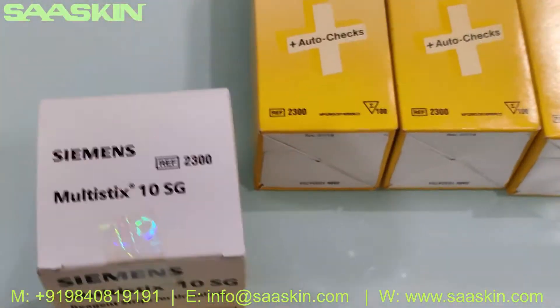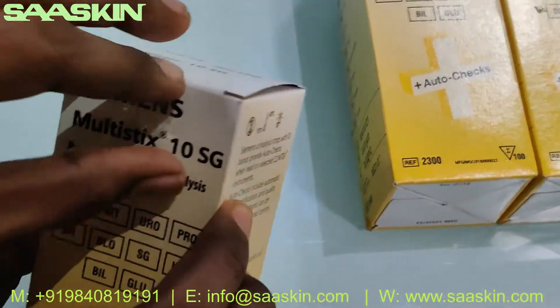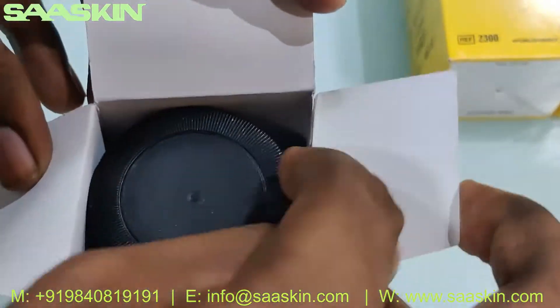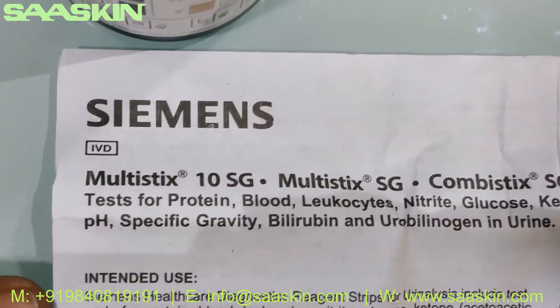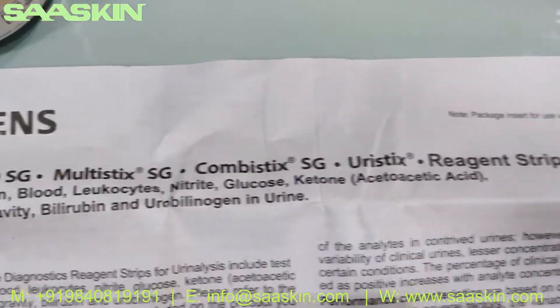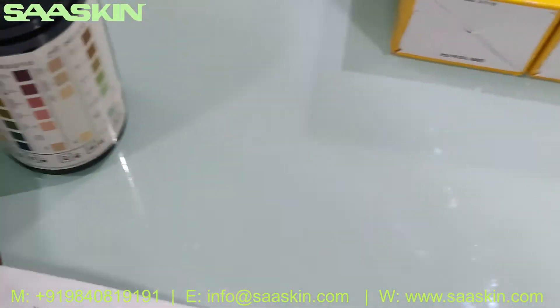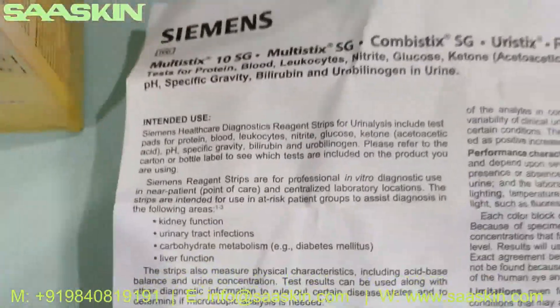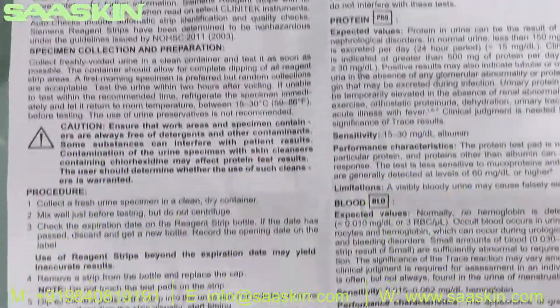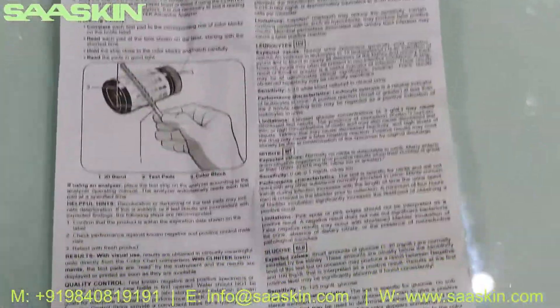This is how the box looks like. Let me open this box for you — we have five boxes here and I'm going to open one. Inside the box you have only one insert — an IFU brochure, like an instruction manual. This talks about the Siemens Multistix 10SG. It's a complete IFU brochure that shows you how to conduct the test and a complete summary of this product, and it comes as part of the box.